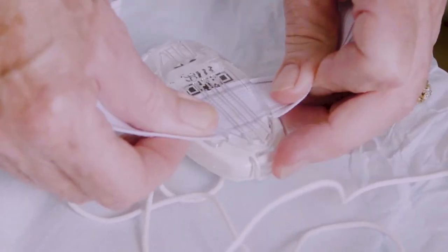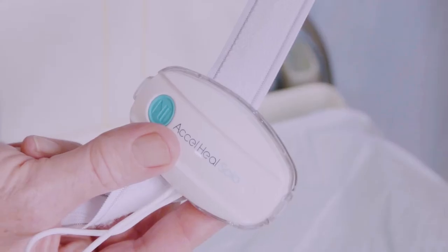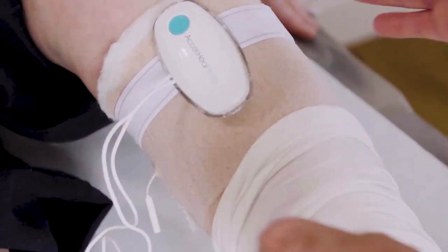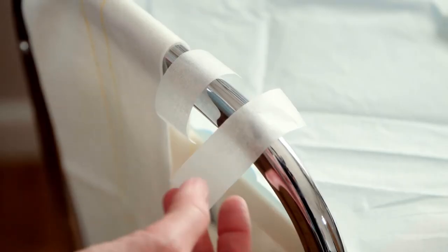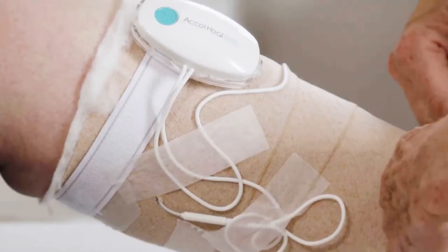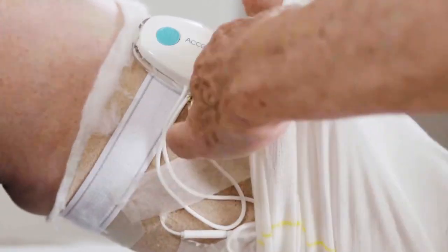Secure the device using the provided removable clip and strap, ensuring it is placed away from bony prominences such as the tibial crest. Secure any free wires with tape.